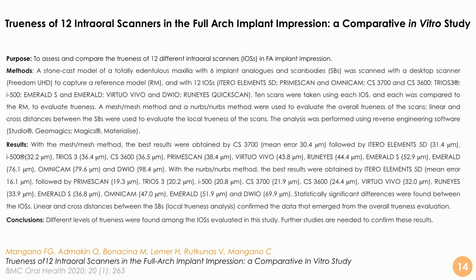It's an in vitro study because, as I told you, it's quite tricky to perform an in vivo study of the trueness of intraoral scanner and model generated by the intraoral scanner if we don't have a reference, and of course in vivo we don't have any reference file. So basically we compared these 12 intraoral scanners, and we captured 10 models with each one of these intraoral scanners. We compared these models with a reference model captured with a very powerful desktop scanner.